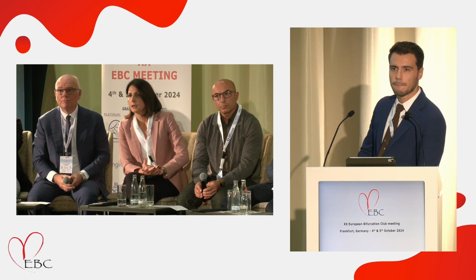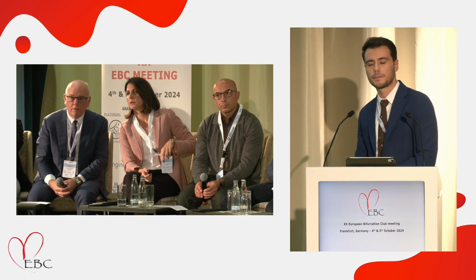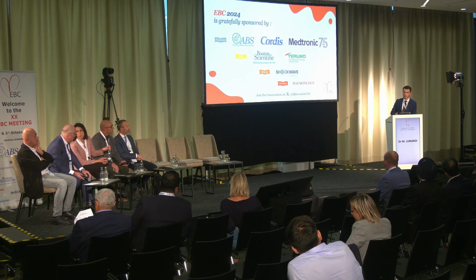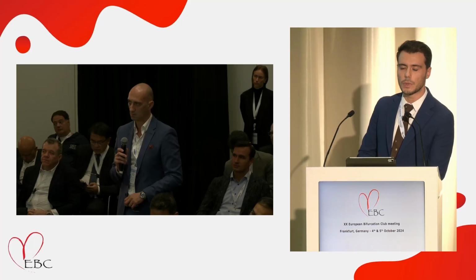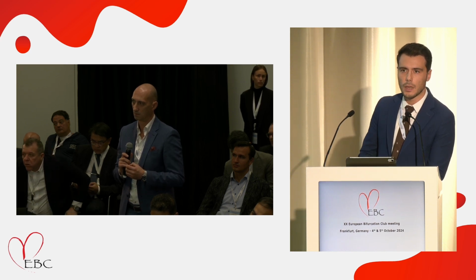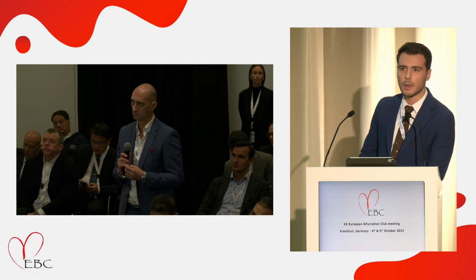Thank you. About the pot side pot, you used a semi-compliant balloon for the circumflex. Yes. You regularly use the semi-compliant, or you can use the NC balloon? It depends on the case. Because in this case, we didn't see any disease, any calcium at the level of the ostium of the circumflex, so we used that semi-compliant balloon just to open the cells and without forcing too much at the level of the bifurcation.